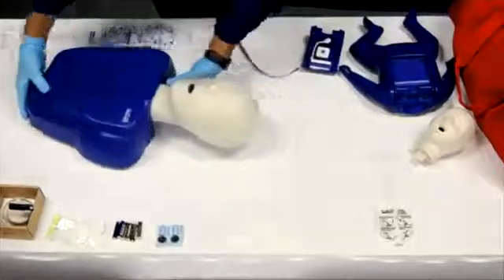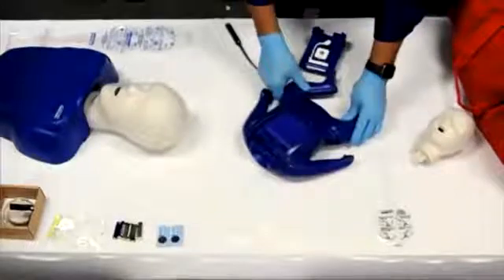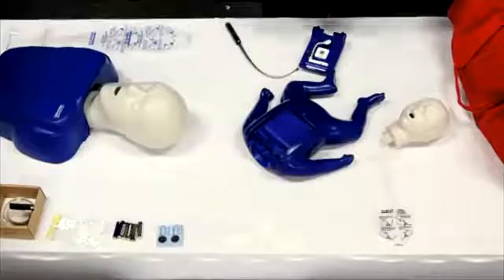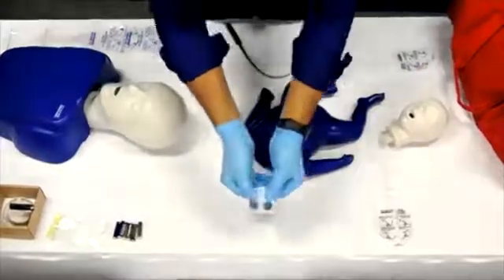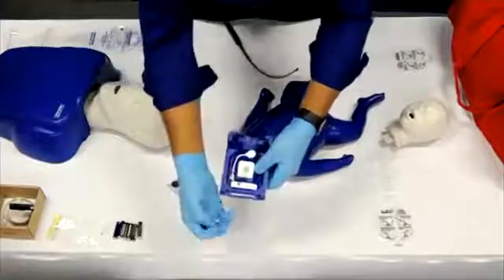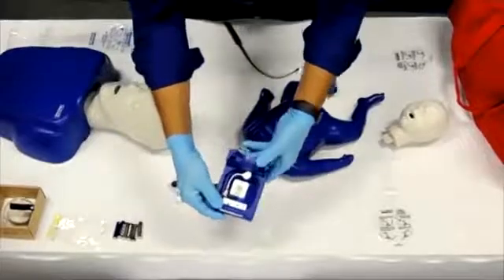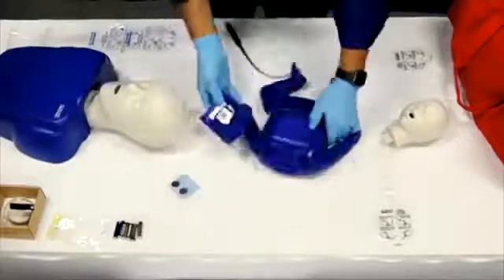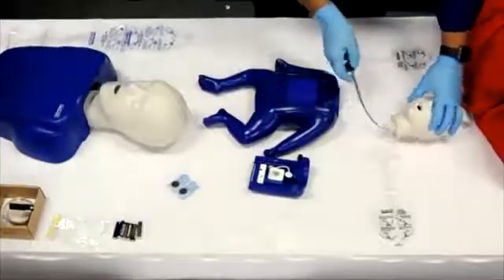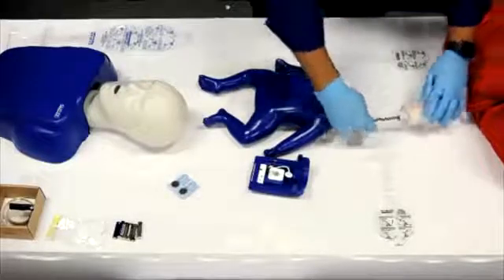The infant mannequins, both CPR Prompt Infant Plus and Baby Buddy Plus, require a CR2032 style battery included with the package. Slide the battery into the electronic component on the back side of the infant's chest plate. Battery installation is the same across both Infant Plus mannequins. So now the application should be ready to open. So we'll go ahead and show you the tablet.